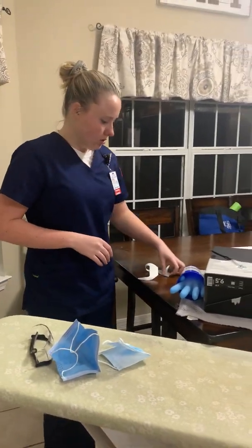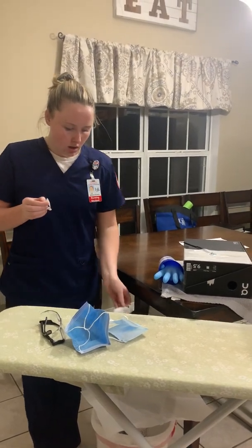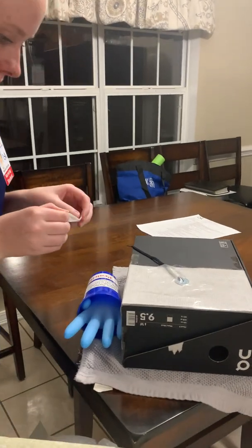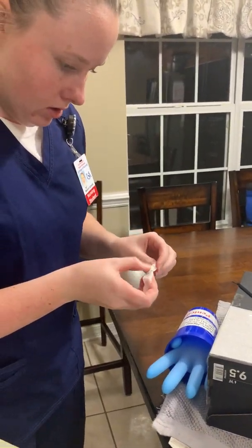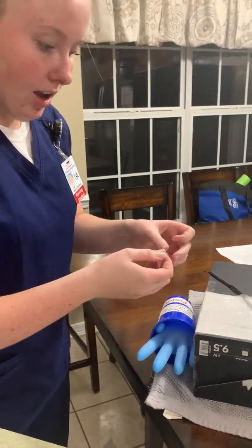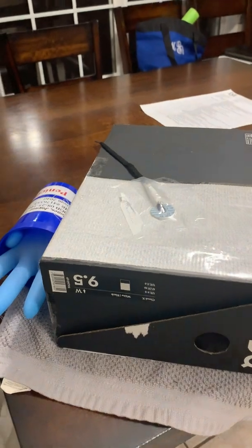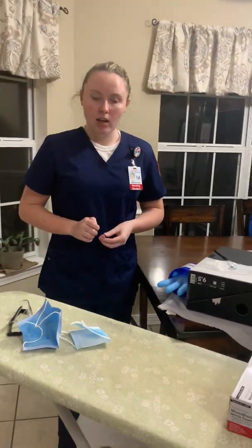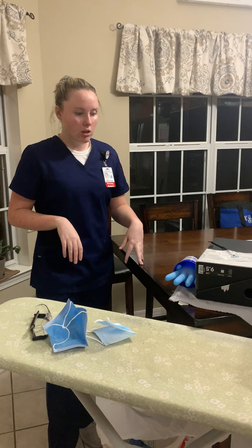And now I'm going to do the label. So I'm going to put the date, the time, and my initials. And I'll throw that away. I would place this on the side of my dressing with the date, time, and initials. And then after that, I'm going to perform hand hygiene and make sure that I lower the bed back to the lowest position.